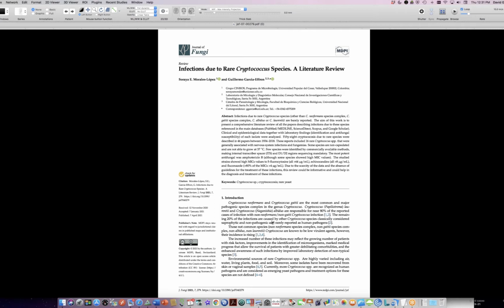I could not find any examples of Naganishia albidus lung infections out there, but we have to presume that this is like a cryptococcal-like organism, and Cryptococcus likes to attack compromised hosts, and an AML patient is definitely a setup for that sort of thing. I think I would have been very suspicious about mucor, given that central necrosis, that bird's nestiness, and the possibility of invasion of the mediastinum along with it.